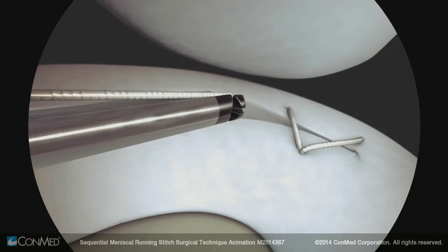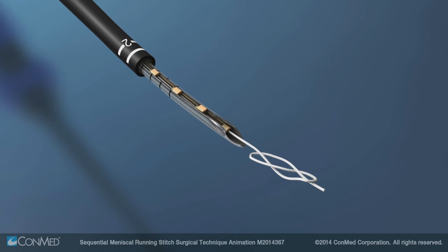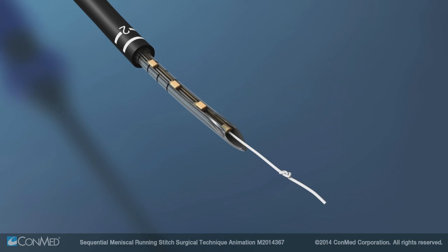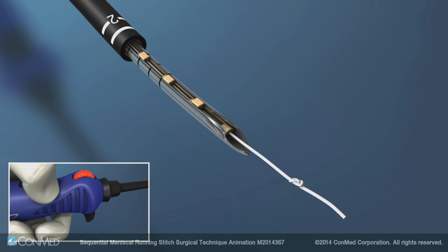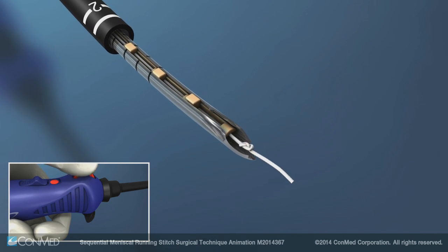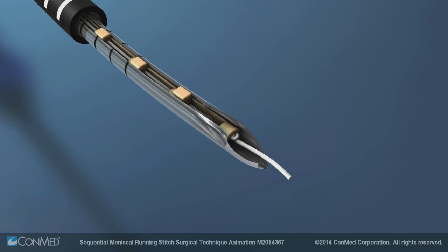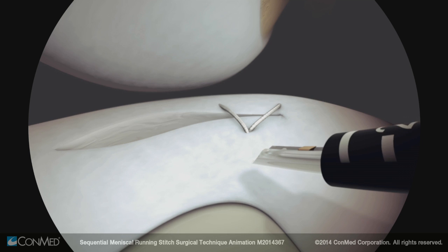Cut the suture flush to the meniscus. Remove the device from the joint and pull out enough suture from the needle to tie a knot. Tie a figure of eight, leaving approximately 10 millimeters of suture tail. Move the switch back to the ratchet position and reel the suture so that the knot is drawn into the starting implant. The device is now reset and can be used to create another continuous stitch.